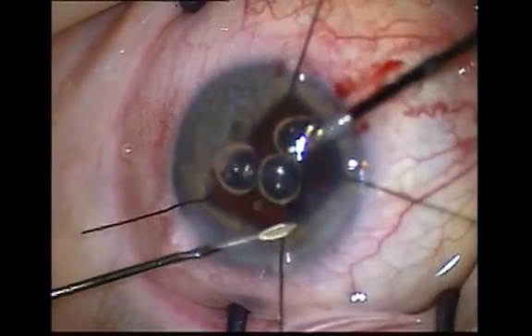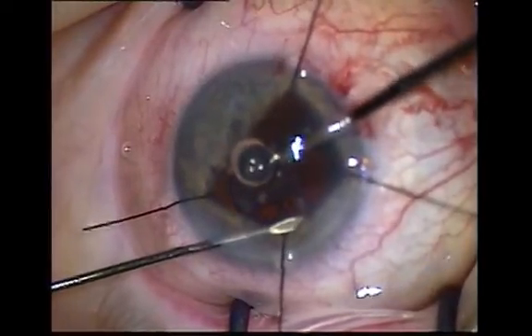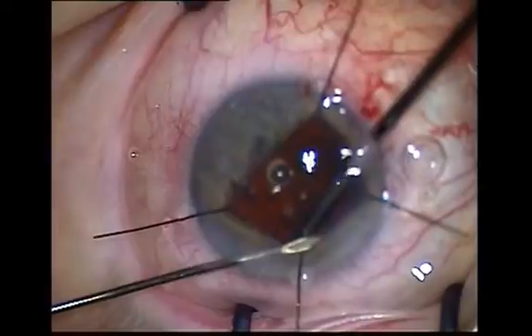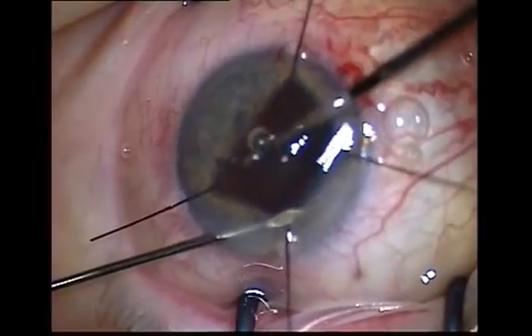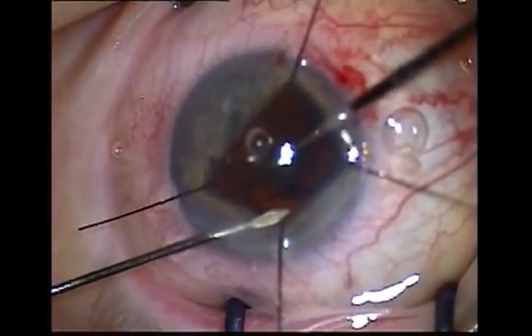Check by passing either the infusion needle or a separate probe across the pupil, looking for pupil tugging. Always do these movements gently. Inject acetylcholine to constrict the pupil and look for any pupil peaking, which is indicative of a vitreous strand still present.